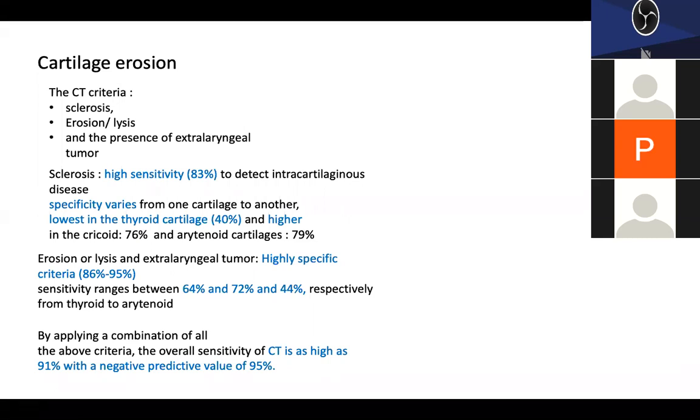So basically, you take CT at two different energy kilovolt points. So one you take at say 120 or 100, and another you take at 140. Then from those two images you can generate different plots. One of them is an iodine overlay plot, where you can basically suppress the calcification, and only the areas of contrast, that is the iodine containing contrast, will show. So this is practiced in Tata. And that is not very common, because I have also not seen these things in Tata, but these papers have been published.